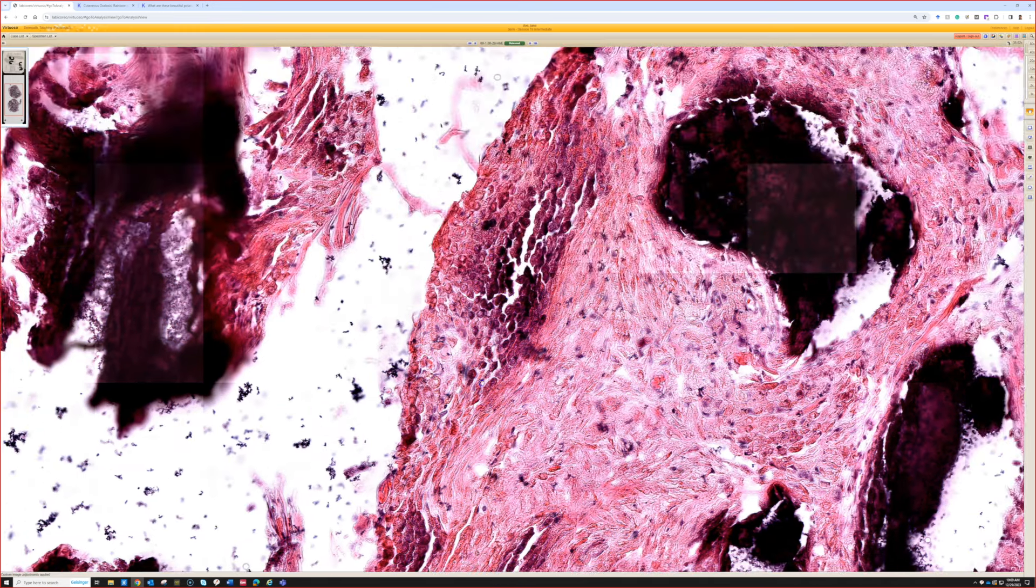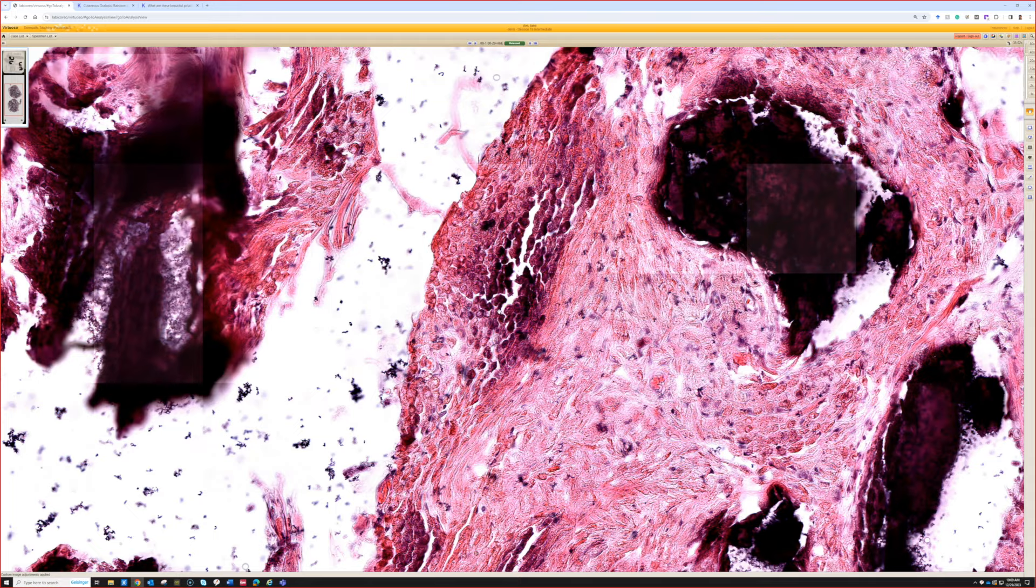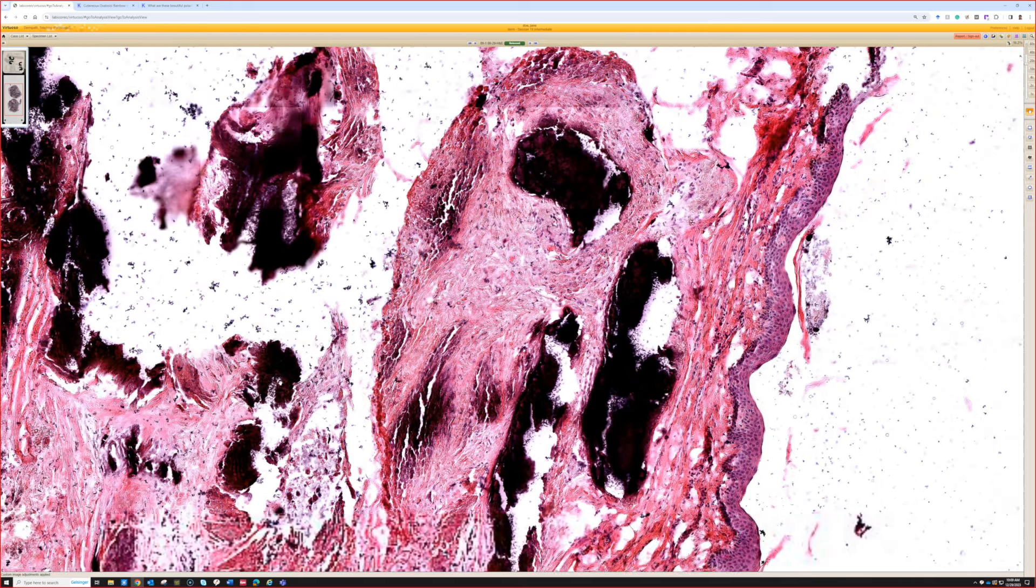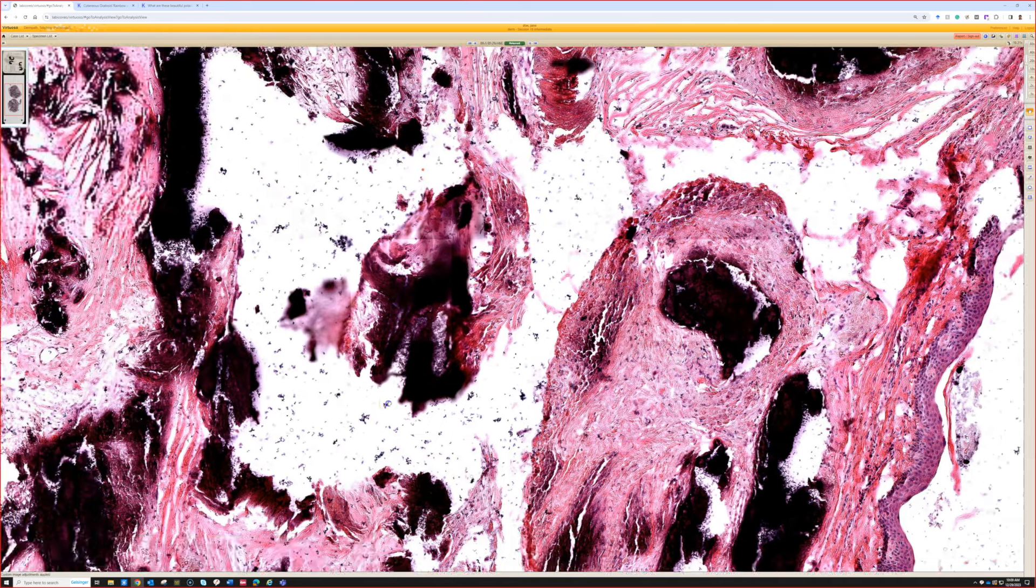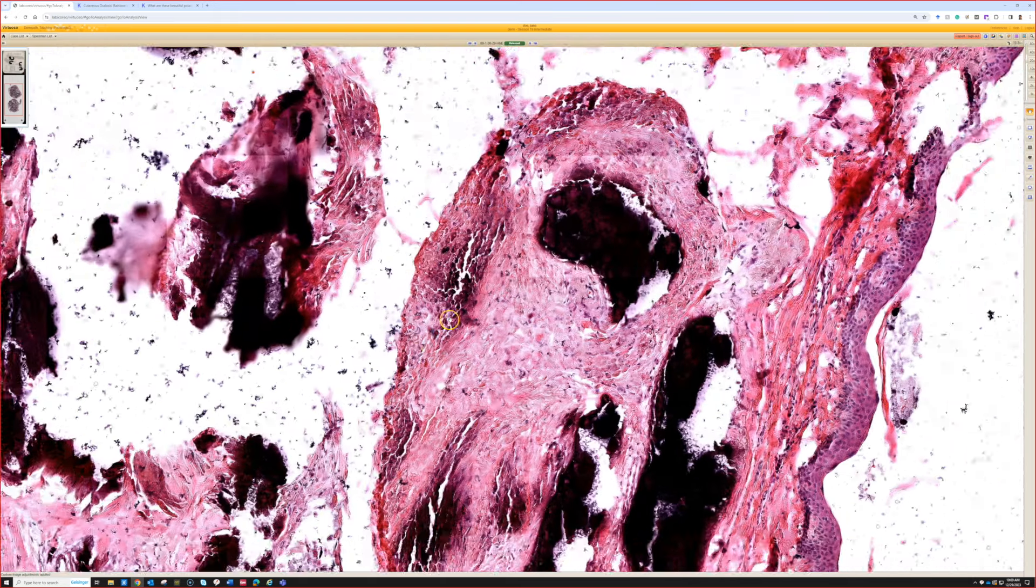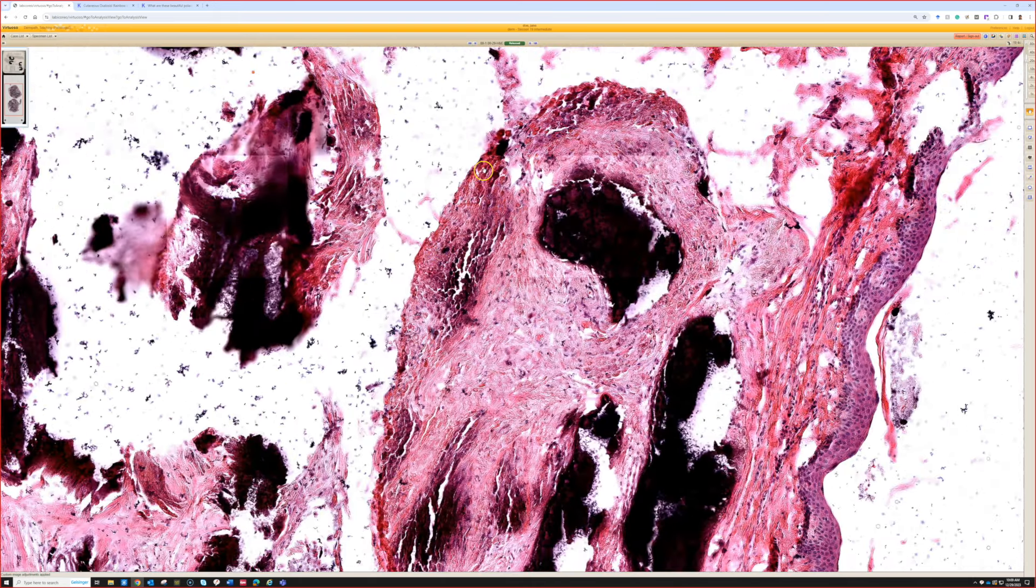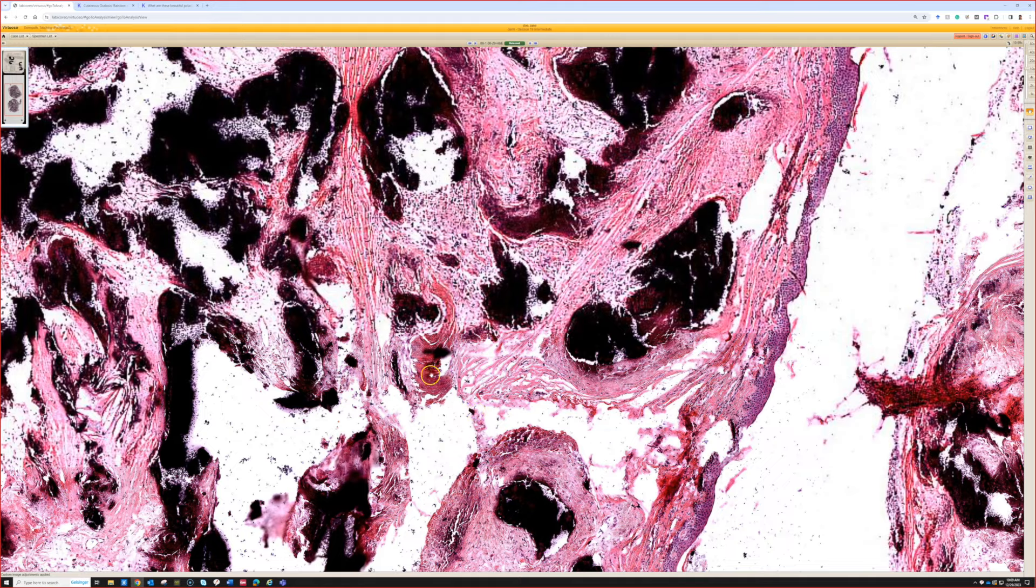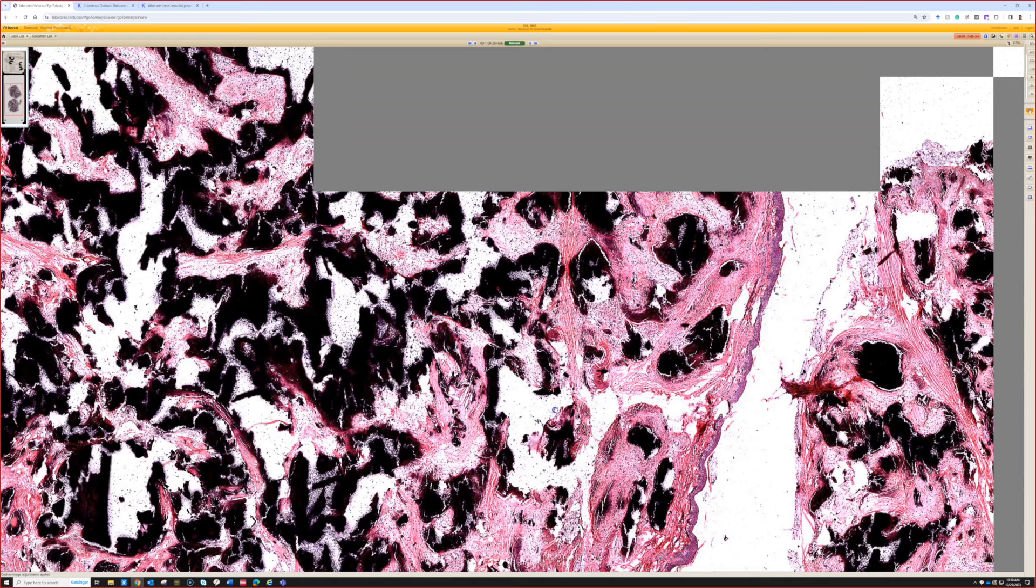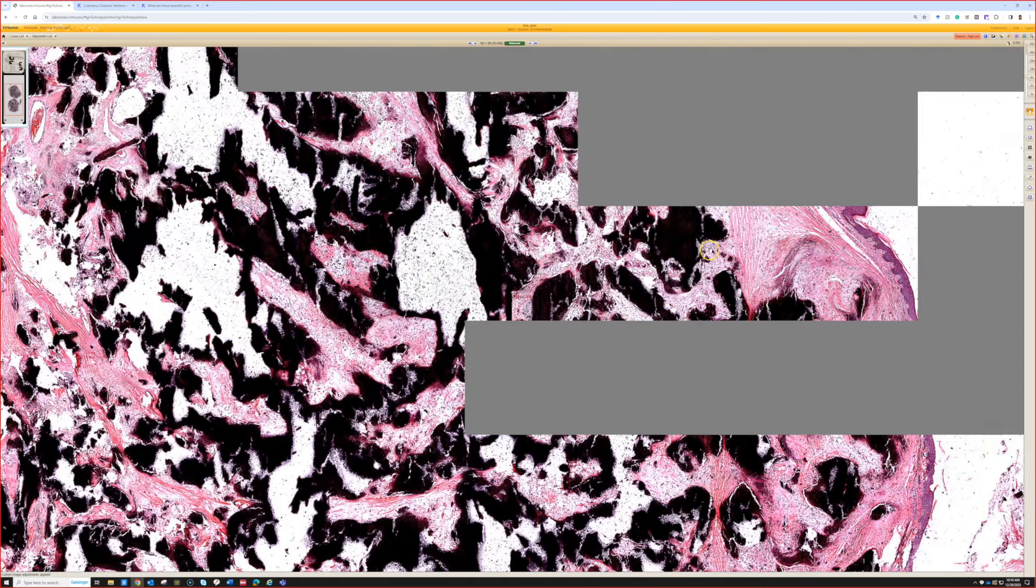These ghost cells here tell me that even though there's tons of calcification, what this actually is is a pilomatrixoma that has extensive calcification and probably some ossification or bone formation. It's very common to get calcification and metaplastic bone or ossification in pilomatrixoma, and sometimes it can be so extensive that it makes it really mimic calcinosis cutis or osteoma cutis. And the way to tell is by finding the ghost cells, the dead keratinocytes or shadow cells that are present, and it can sometimes be very very focal. If you called this calcinosis cutis or osteoma cutis though, I mean nothing bad would happen to the patient unless they were really worried that there was a systemic problem.